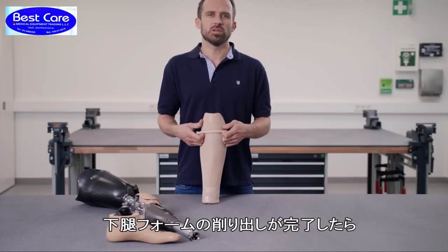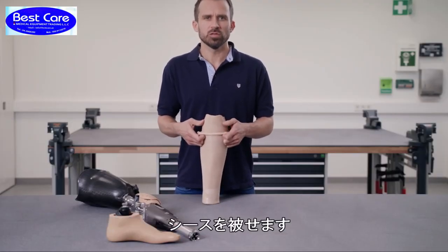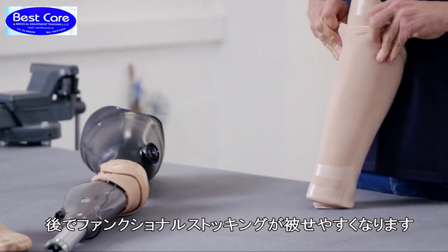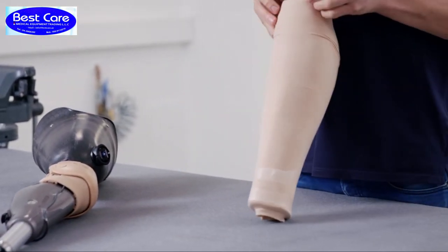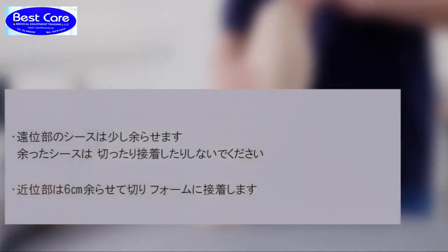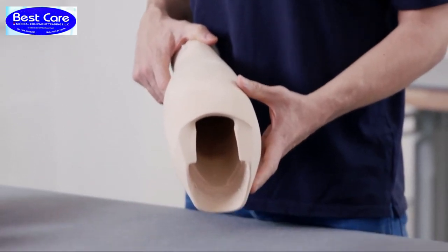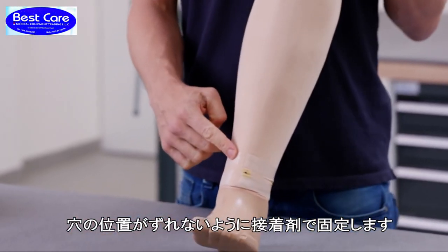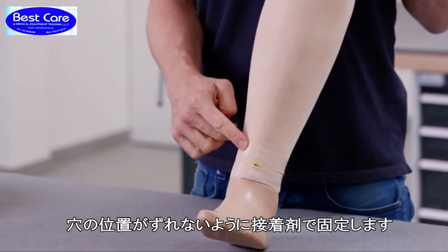Once the sanding of the shank is completed, you have to pull the nylon stocking over it to make it easier to put on the functional stocking later. Secure the holes that you need to make with contact adhesive as well to avoid fraying.